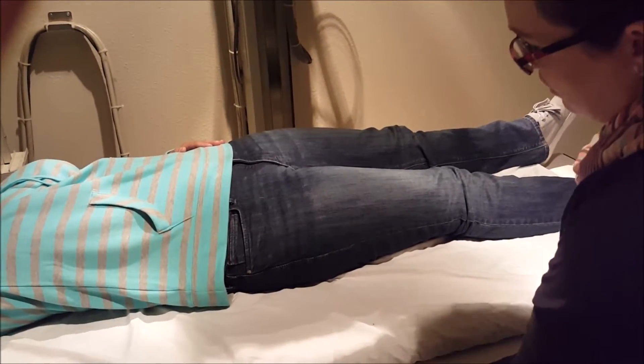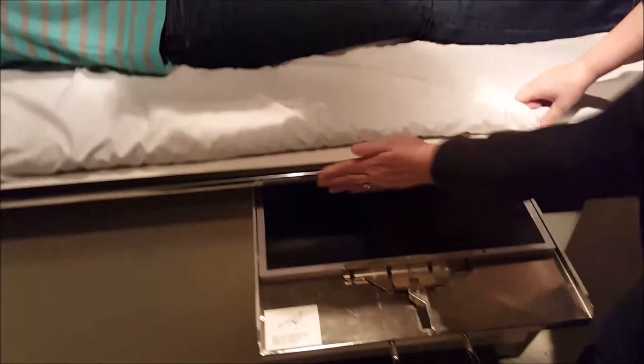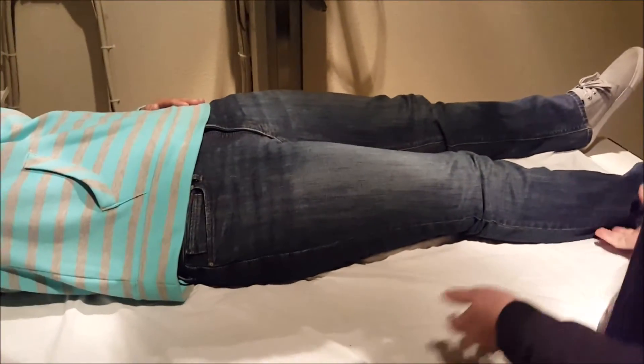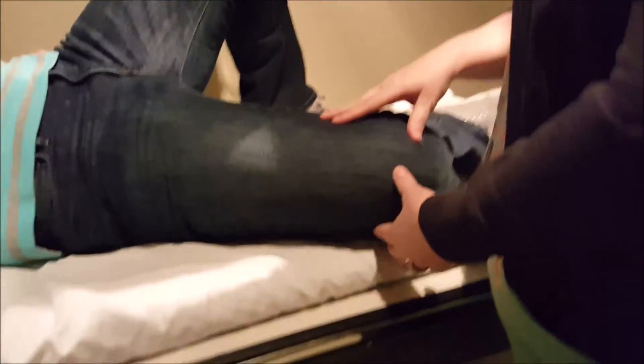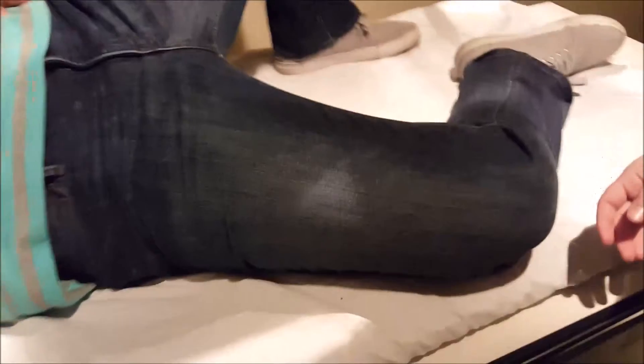We're going to have a 40 inch SID. We're still going to be using a 14 by 17 inch cassette and we still want to keep it in a portrait orientation. We're going to have our patient bend up their knee and kind of relax their leg out to the side, and have them roll out to the side. That way you're nice and lateral because we want to make sure we have our knee in a lateral position.